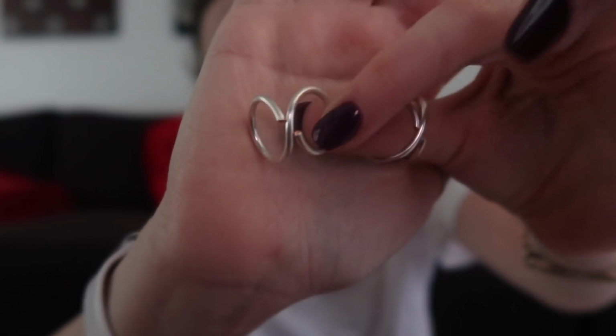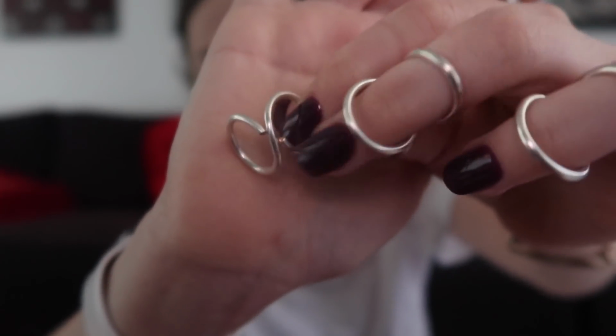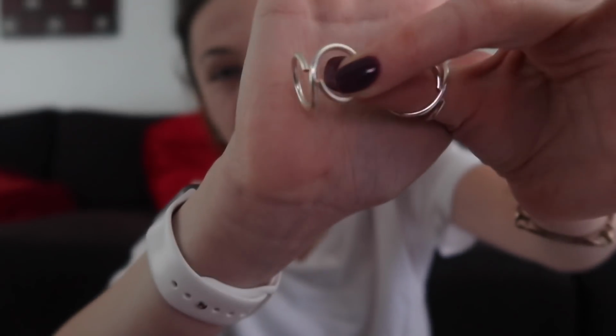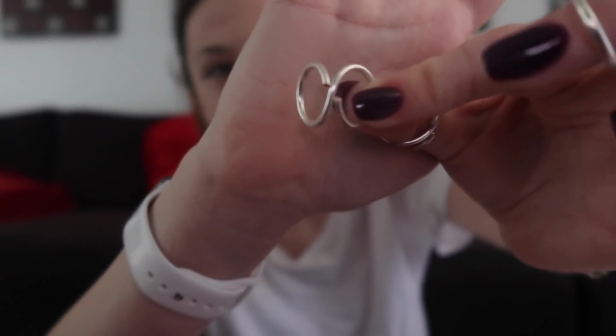Now, I will give a little disclaimer because I know this is not going to be for everybody. They are not sealed, these splints, if I show you what I mean by that. See what I mean? They are just kind of curved. But if that was a real issue for me, I could get those soldered or welded, if it was really bothering me.